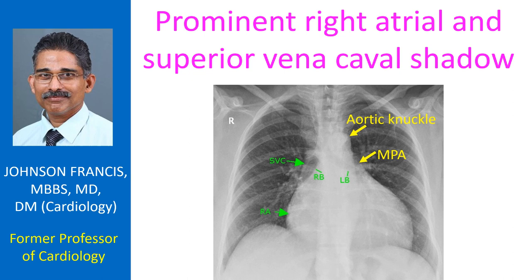The right bronchus can be seen as a more vertical air column than the left bronchus, which is more horizontal. In general, the vascular markings in the lung are a bit more prominent than usual.